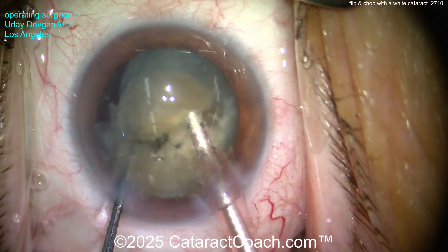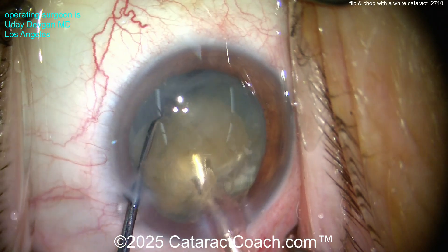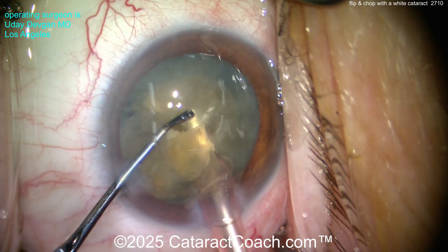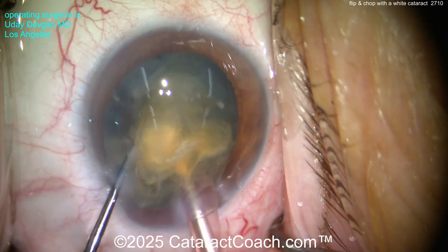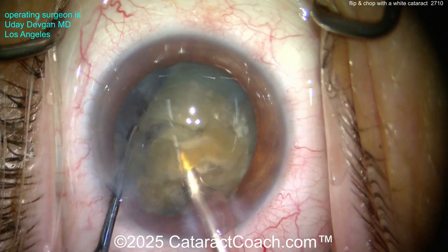Good nuclear density. You might say, wait — a white cataract like this, this patient can't have a clear cornea the next day. I promise it's a clear cornea. Watch this. Now we're using phaco power modulation to minimize phaco energy — pulse mode with a low duty cycle, like 30 to 40 percent at most. Look how we're just buzzing the nucleus: chop, chop, and more chop, creating these small little fragments.